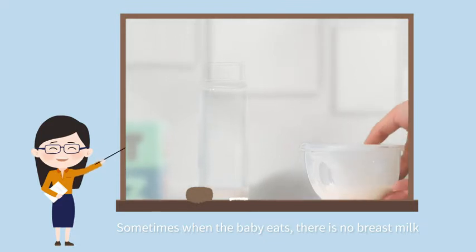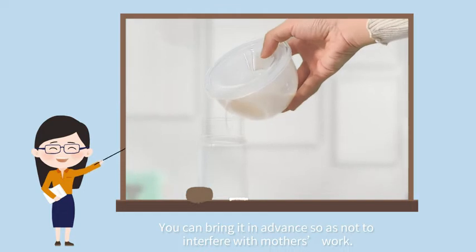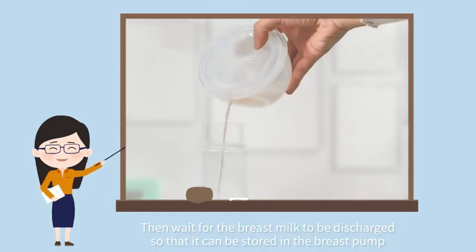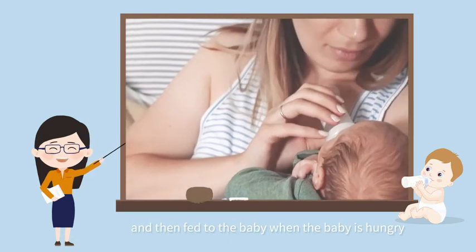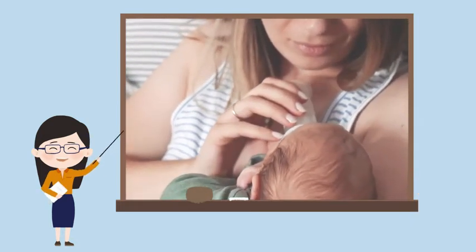Sometimes when the baby eats there is no breast milk. You can use it in advance so as not to interfere with the mother's work. Then wait for the breast milk to be expressed so that it can be stored, and then feed the baby when the baby is hungry.